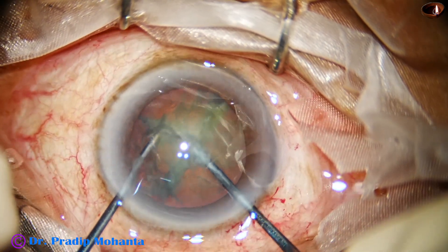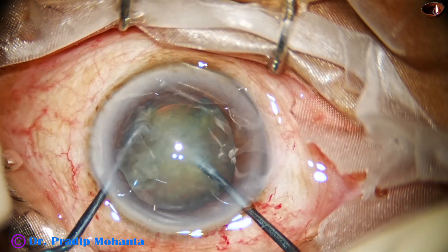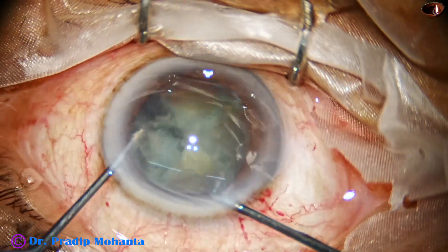This hemi nucleus is then divided into two. We turn and come to the other hemi nucleus, and this is also divided into two.